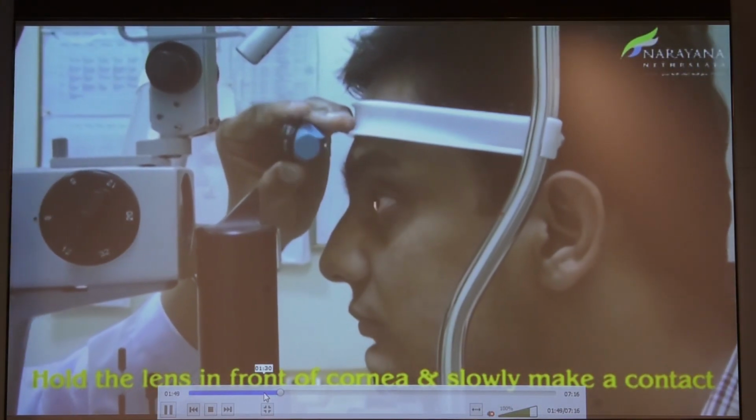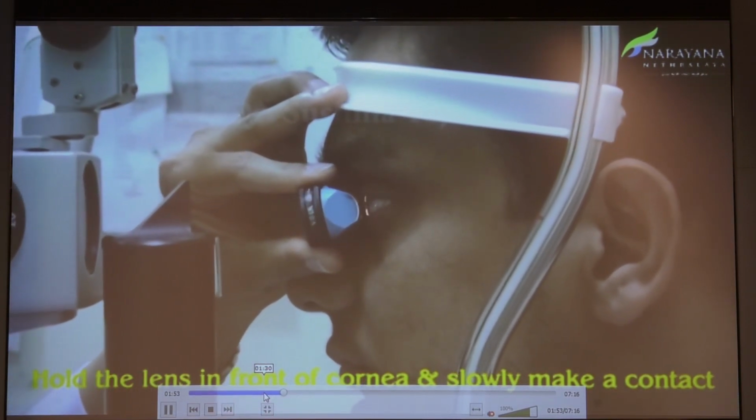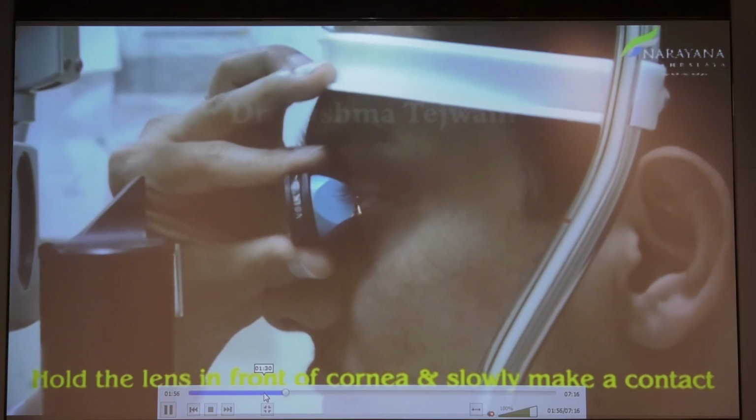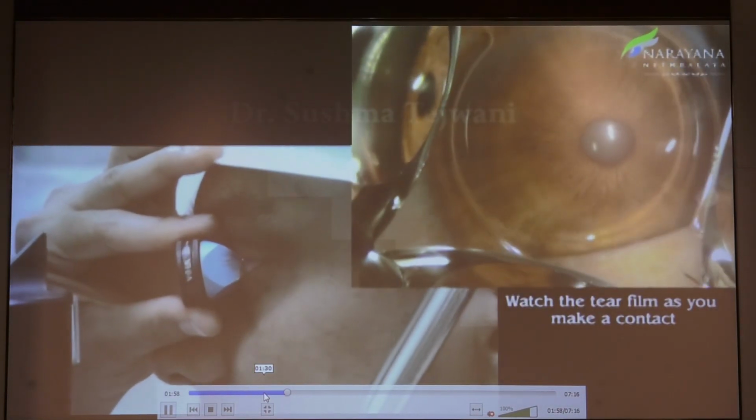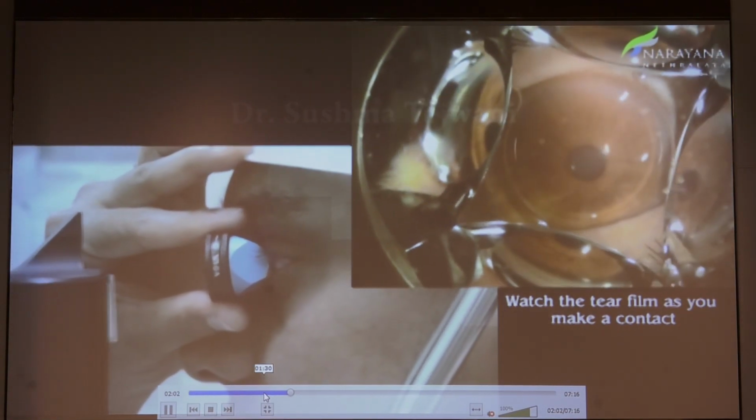In case of a 4-mirror, it is very simple. You just hold the lens in front of the eye. You ensure that the tear film is uniform between the lens and the cornea. That is when you start seeing the angle, and then you can go to the angles.